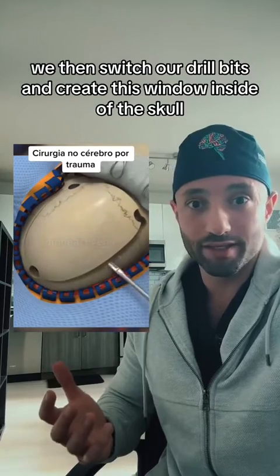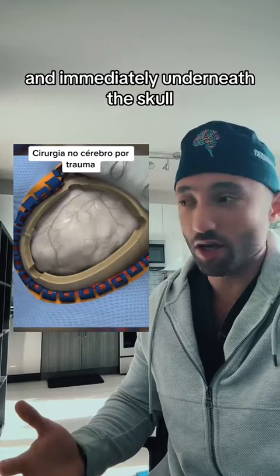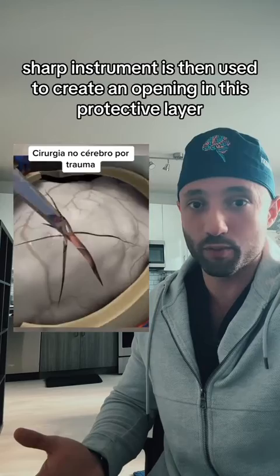We then switch our drill bits and create this window inside of the skull to gain access to the brain. Immediately underneath the skull, there is this protective layer — comment if you know the name of it. A sharp instrument is then used to create an opening in this protective layer.